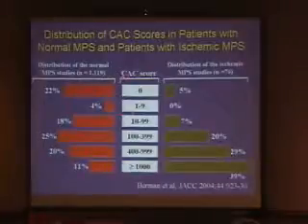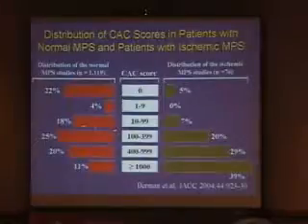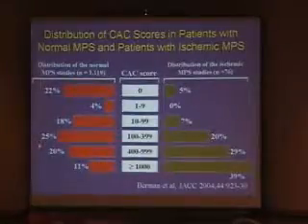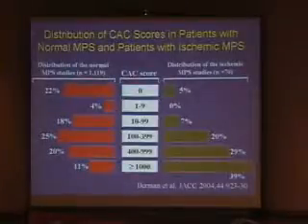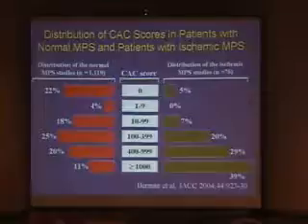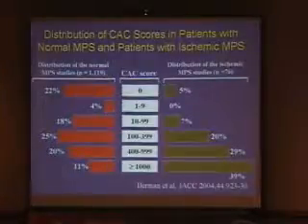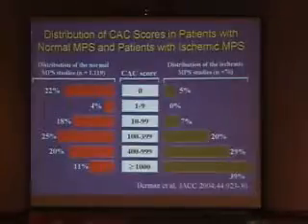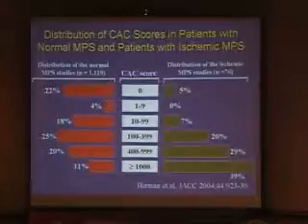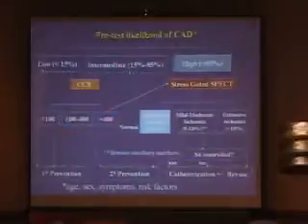In that population, we're showing on this slide the frequency of the various different coronary calcium scores. 56% of our patients with normal stress myocardial perfusion studies had coronary calcium scores over 100, which has been defined tonight as being a prognostically important level where aggressive medical therapy would be appropriate. And if you don't like that cutoff, you want to be even more conservative and you say it's got to take a score of 400 or greater for me to be very aggressive with medical therapy, 31% of our patients fit in the group of having extensive calcification and a normal nuclear scan.